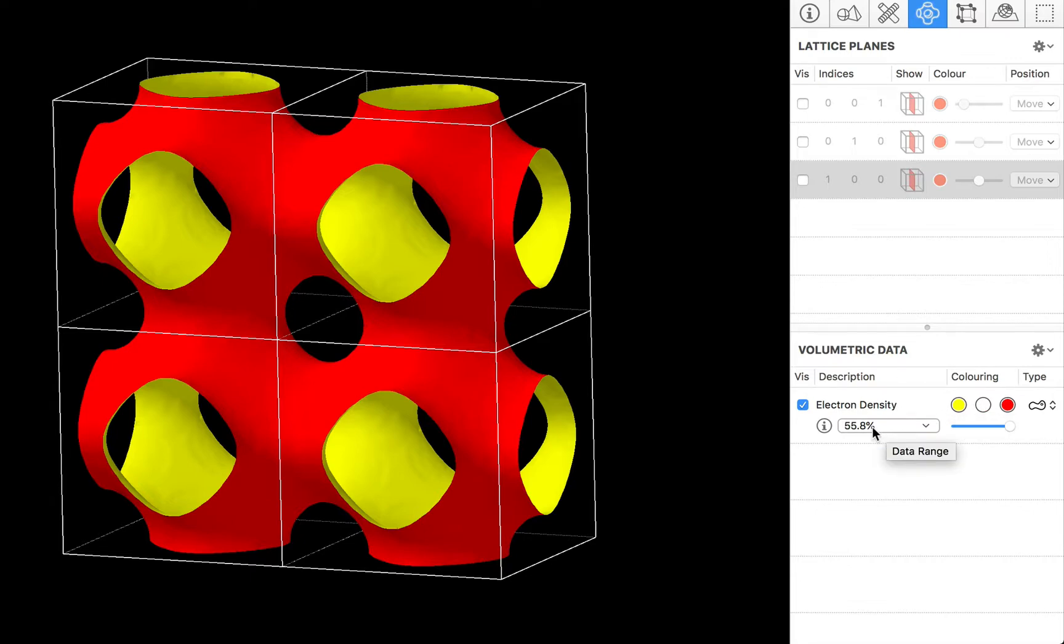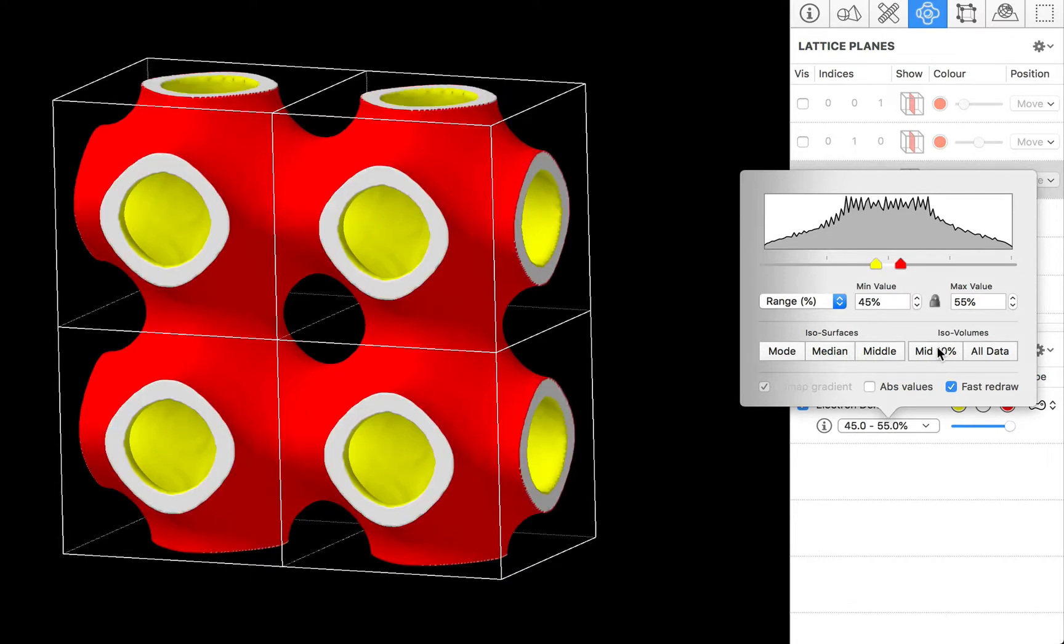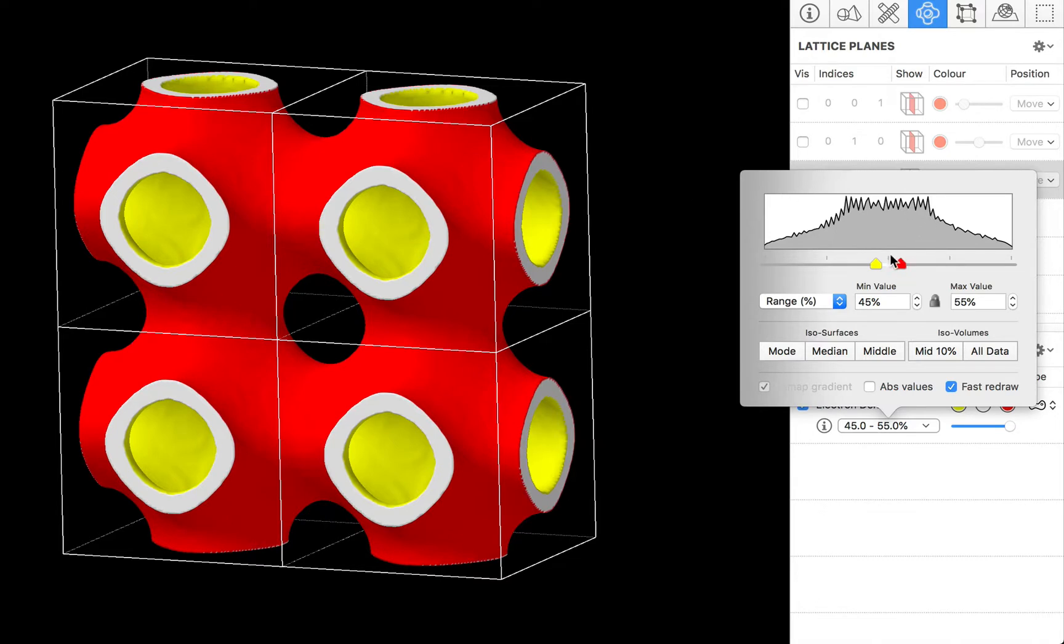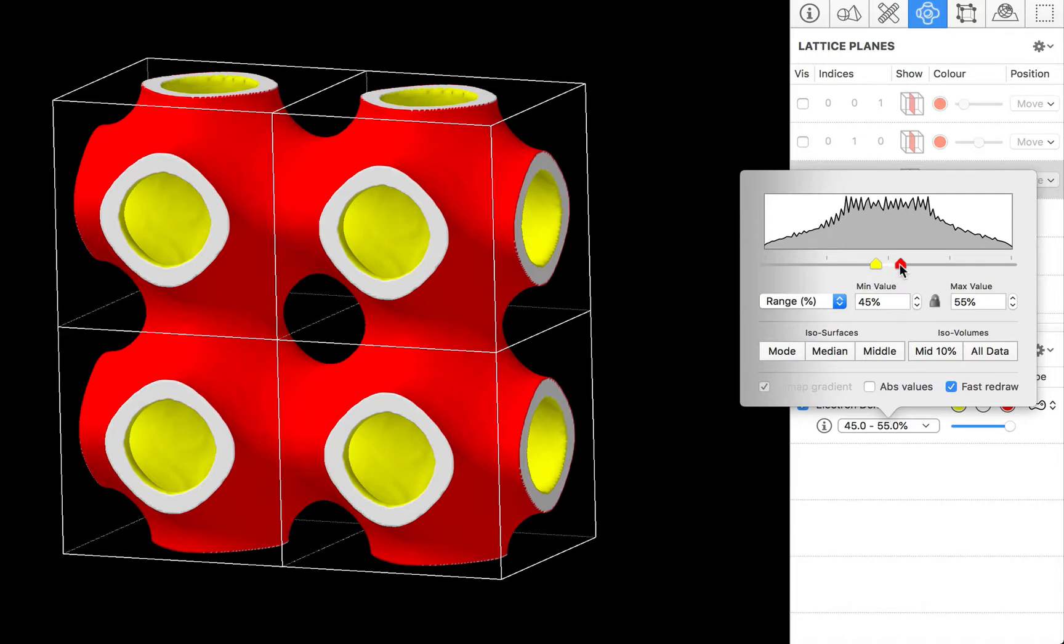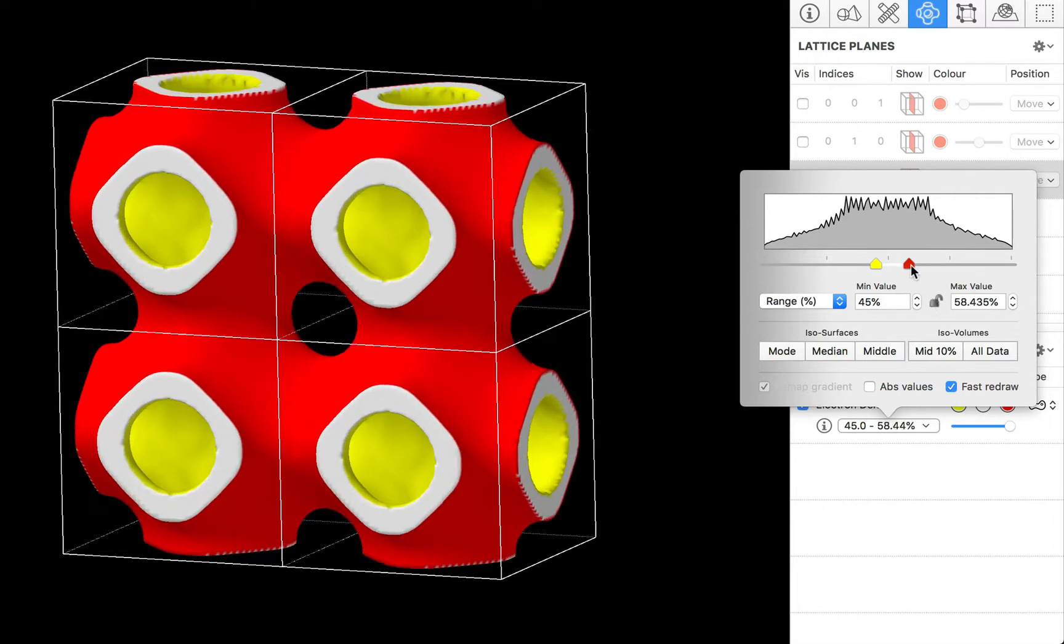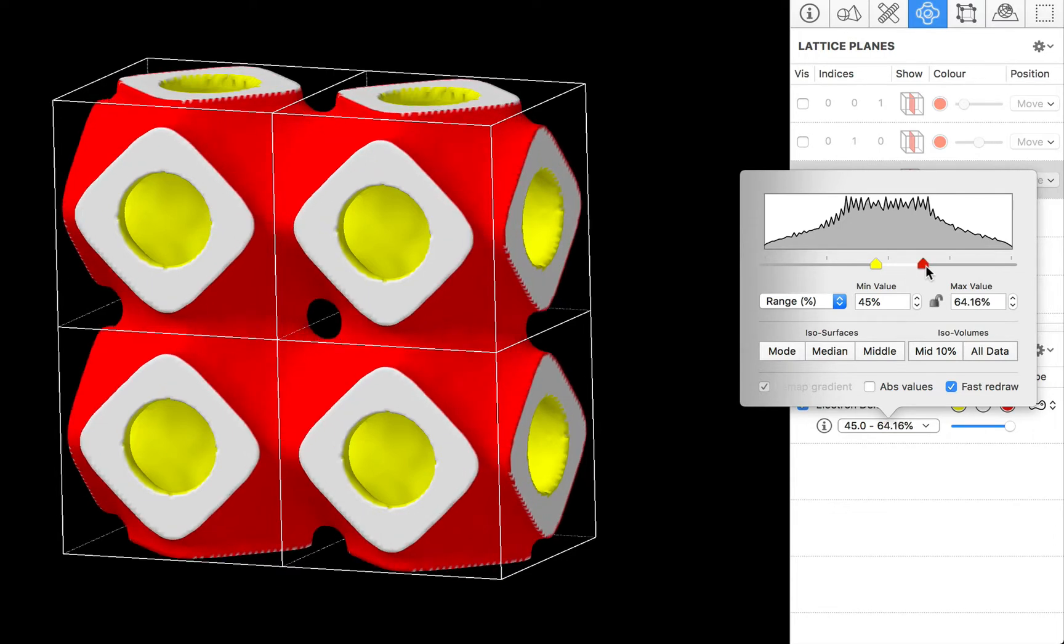We will go back to our data range popover and we are going to switch to an ISO volume. Now you can see that the white area corresponds to the truncation colour. The red area which you can also see mirrored on this red slider bar thumb corresponds to the maximum data points and the yellow corresponds to the minimum data value. And again we can unlock this data range and we can make our ISO volume larger just by dragging the extent.